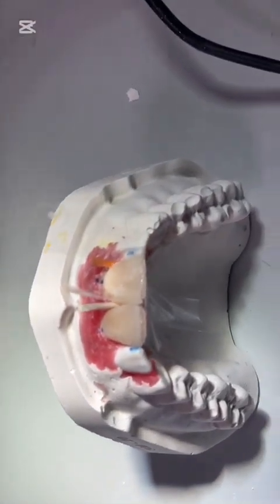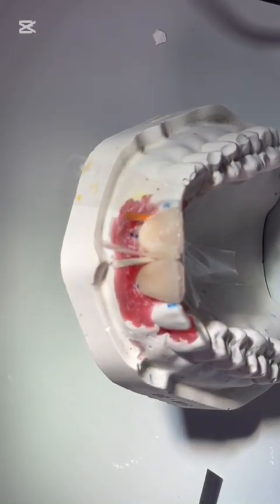Okay, now I think I should increase the bulkness here on the incisal edge mesially. So I will add more composite.